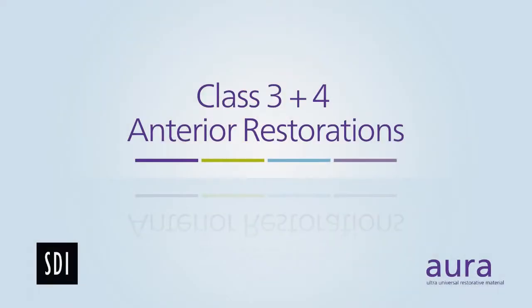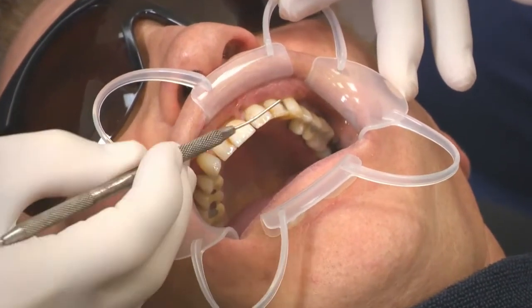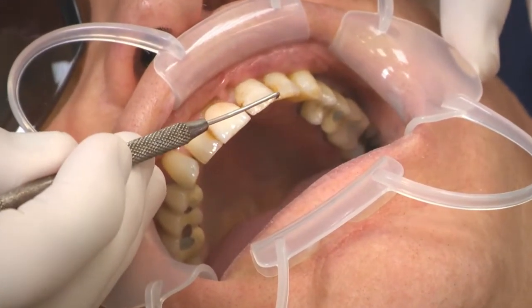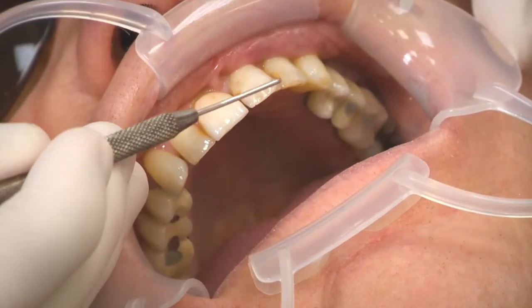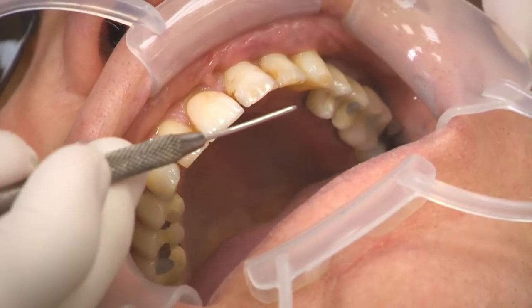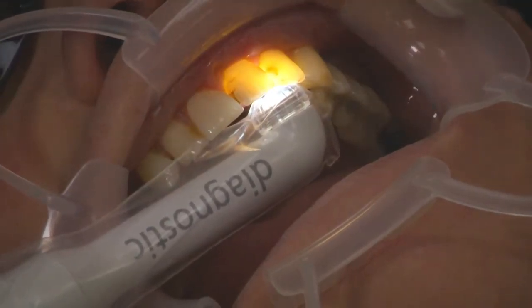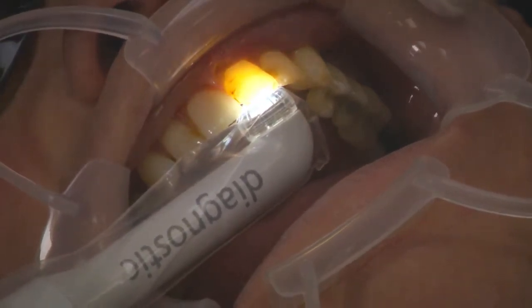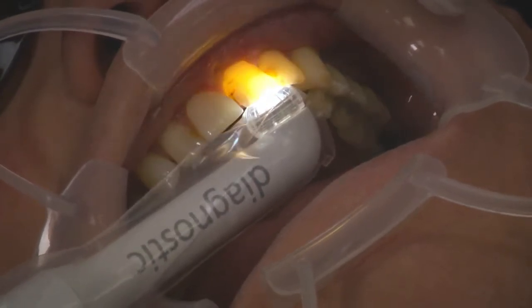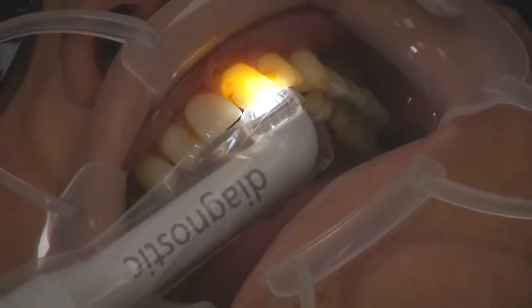In the Class 3/4 situation today, you can see the old leaking composites that have been in place for probably 10–15 years. We've also got the potential for a small crack running through this area, which we're concerned may well become a Class 4 restoration. Using our Radii Plus transilluminator, we can see the old composites and microcracks running down through that area — and a crack heading down towards the Class 3 composite on the upper left central — so we're anticipating a Class 4 restoration there.